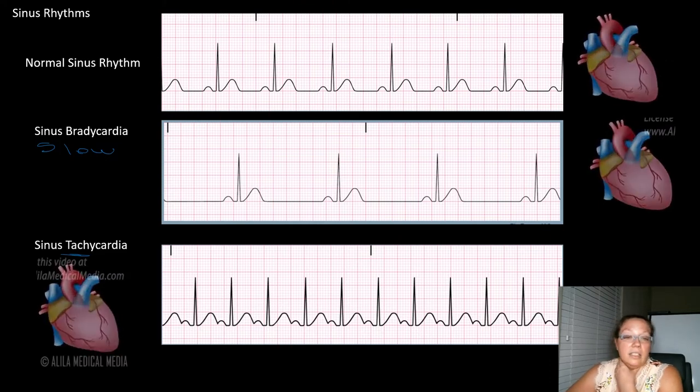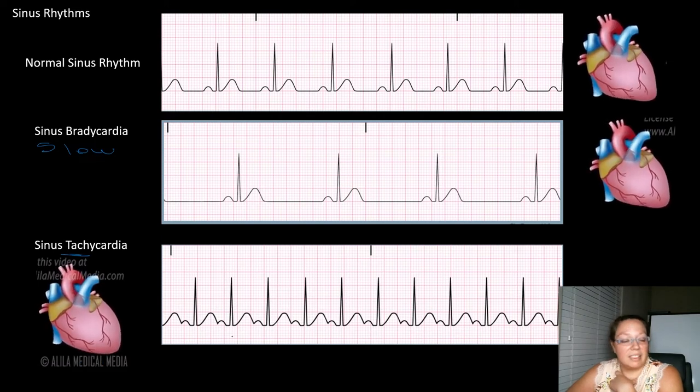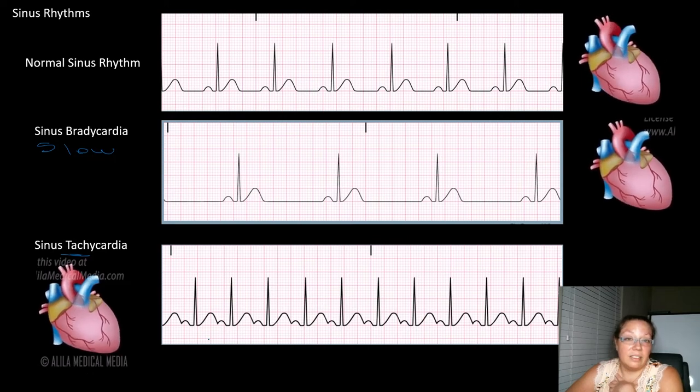What does that look like? All right, it looks like this sinus, right? The atria go, the ventricles go. Atria, ventricles, but super fast. This can be hard on the patient because you're not giving the heart enough chance to get blood filling up in those areas, right? If you're sitting in the bed and you're tachycardic like this, it can cause some issues because you're not being able to get enough blood. If you're exercising, I mean, that's fine. You're going to have an increased heart rate. It doesn't mean that you're going to be unstable from it. It means that you're still being able to pump blood around.